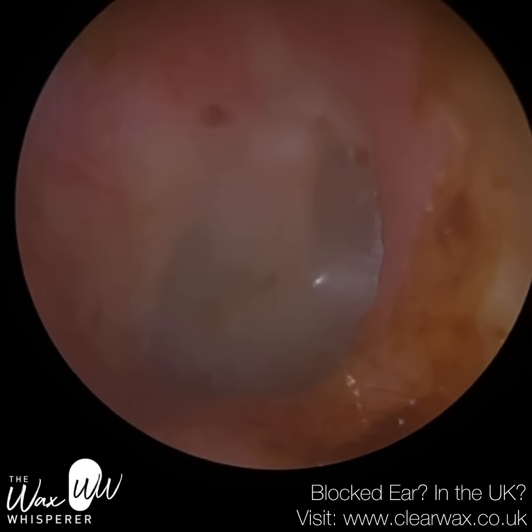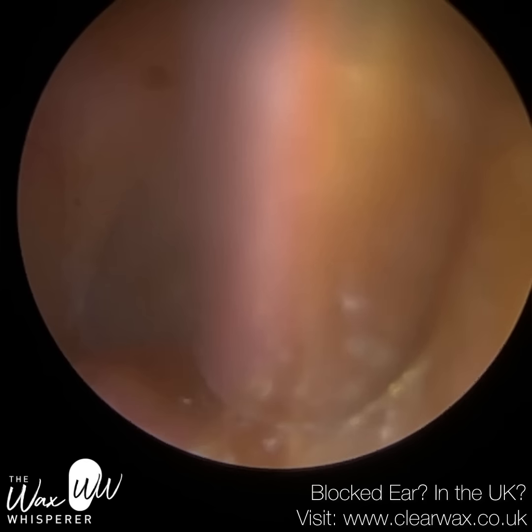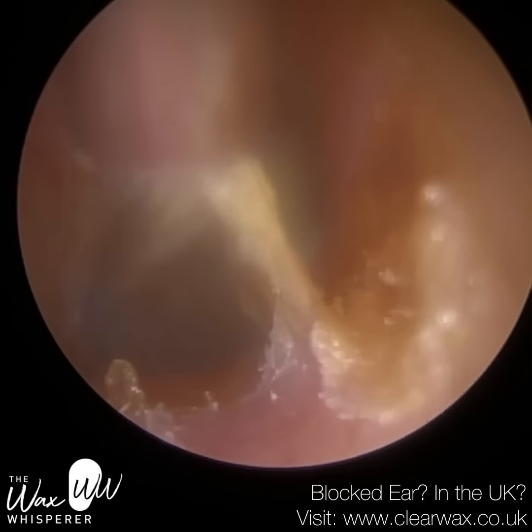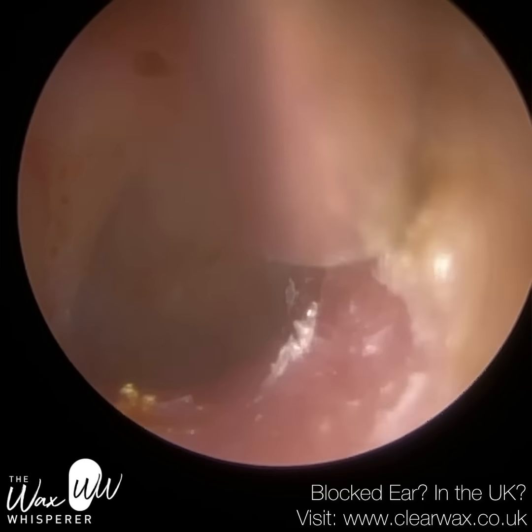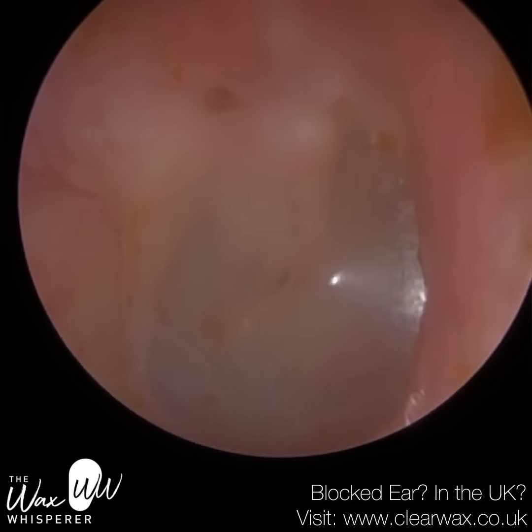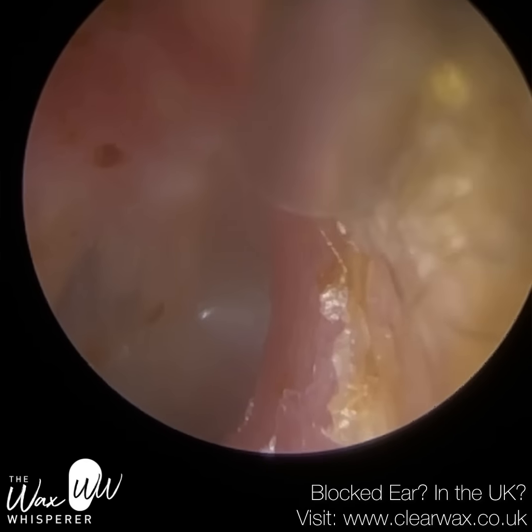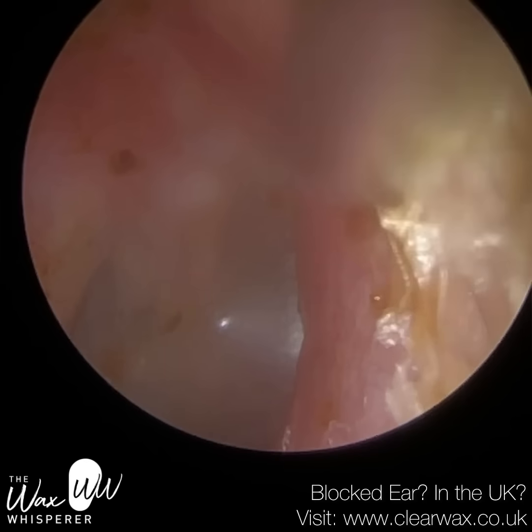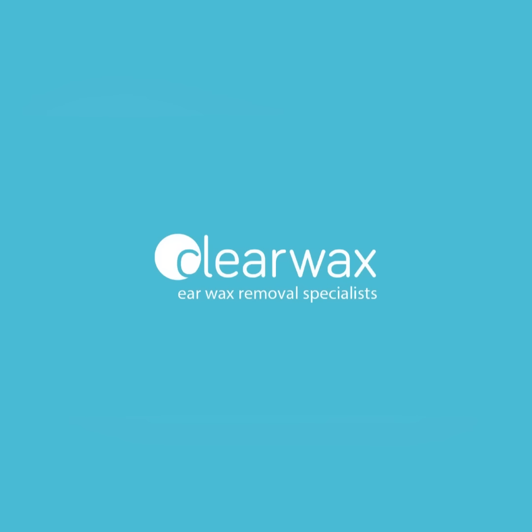There's a bit of sticky wax — I'm just going to hover over it. It comes away, brilliant. The reason I'm trying to remove more in the inferior part of the ear canal is that more recently I've been uncovering some pathologies there, such as benign osteonecrosis where there's decaying of the underlying bone creating a dip or pothole in the ear canal, or external canal cholesteatoma, which is very rare — it's when skin yet to shed collects in part of the ear canal and builds into a plug, then releases proteolytic enzymes which can ulcerate the skin due to periosteitis, an infection of the periosteum supplying blood and nerves to the bone. I hope you enjoyed that video — take care, keep well, and speak soon. Bye.